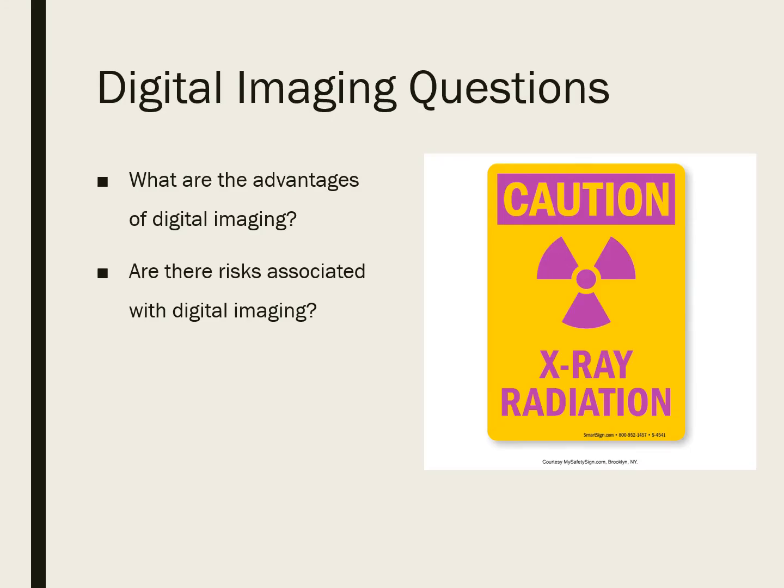All right. And so while I've never had a patient specifically ask what the advantages of digital imaging are, I have on many occasions talked to my patients about how the digital imaging that we are using is safer than the traditional film, right? Because we know that digital uses less radiation. And so when this gives you this question, it's probably giving you some information the other way around, in that you said digital imaging is safer. So then the patient's like, well, how is it safer? That's probably more along the lines of what would happen than asking what the advantages of digital imaging are.